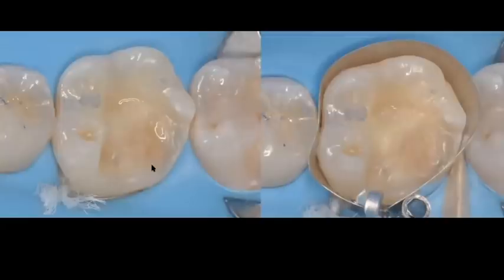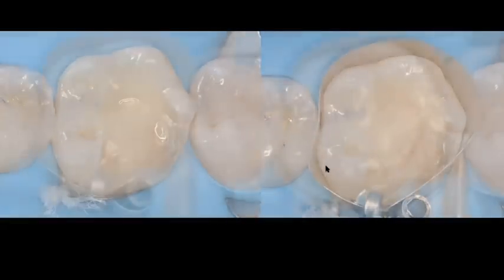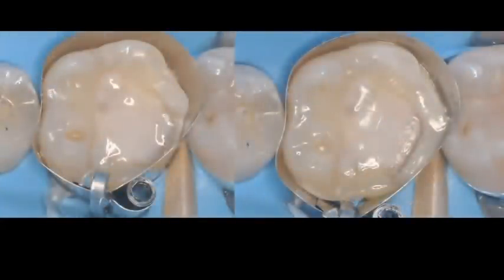And there's a couple of things that you can do. One of the things that I like doing is using a liner, because we all know that with a resin-modified glass ionomer liner, like for example Vitrebond or Ultra Blend, all these different types of liners, you can apply it on the dentin and you are going to get an immediate seal of that dentin. So now if I go ahead and acid etch, do a total etch technique, my deep dentin is protected.